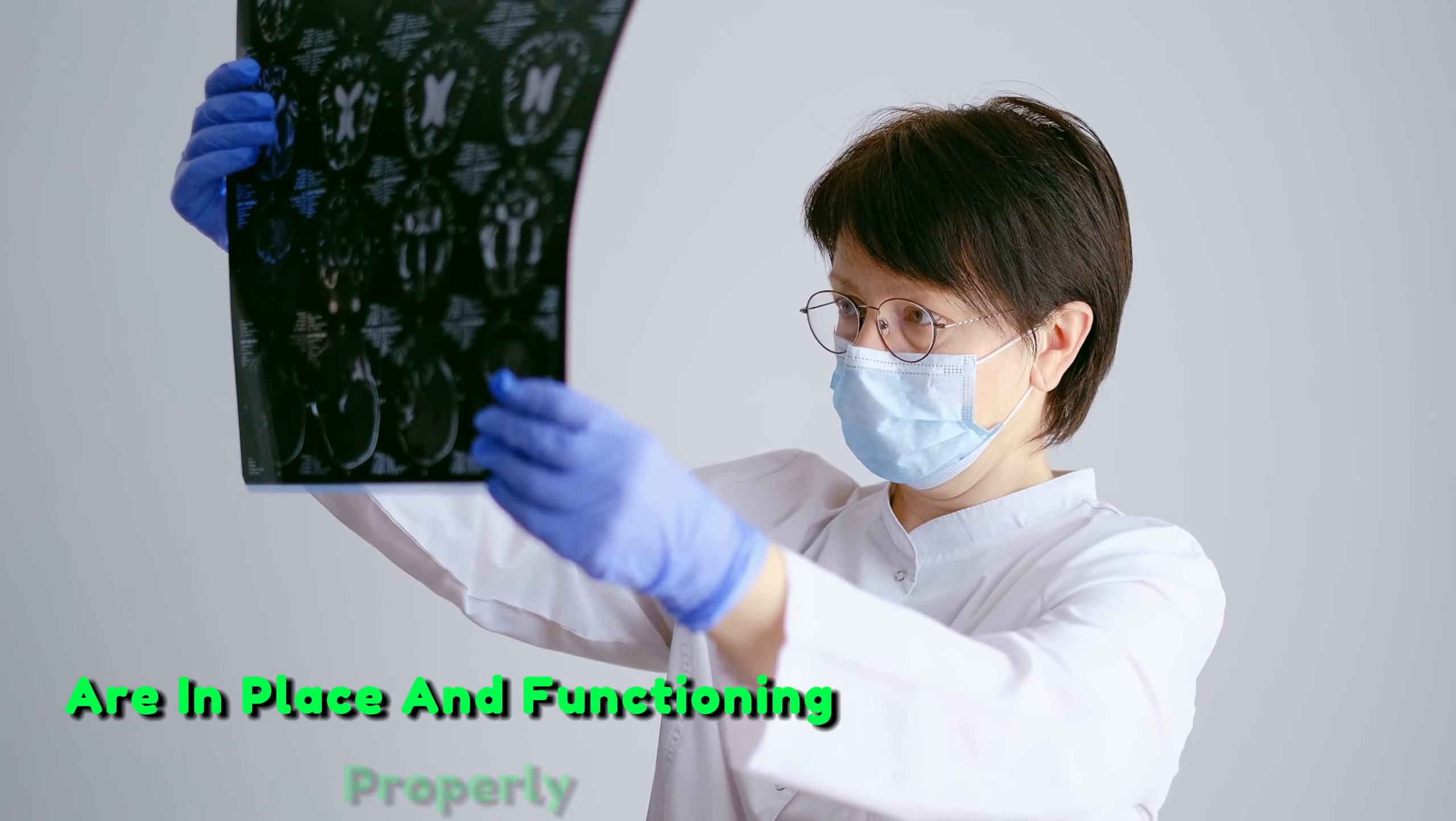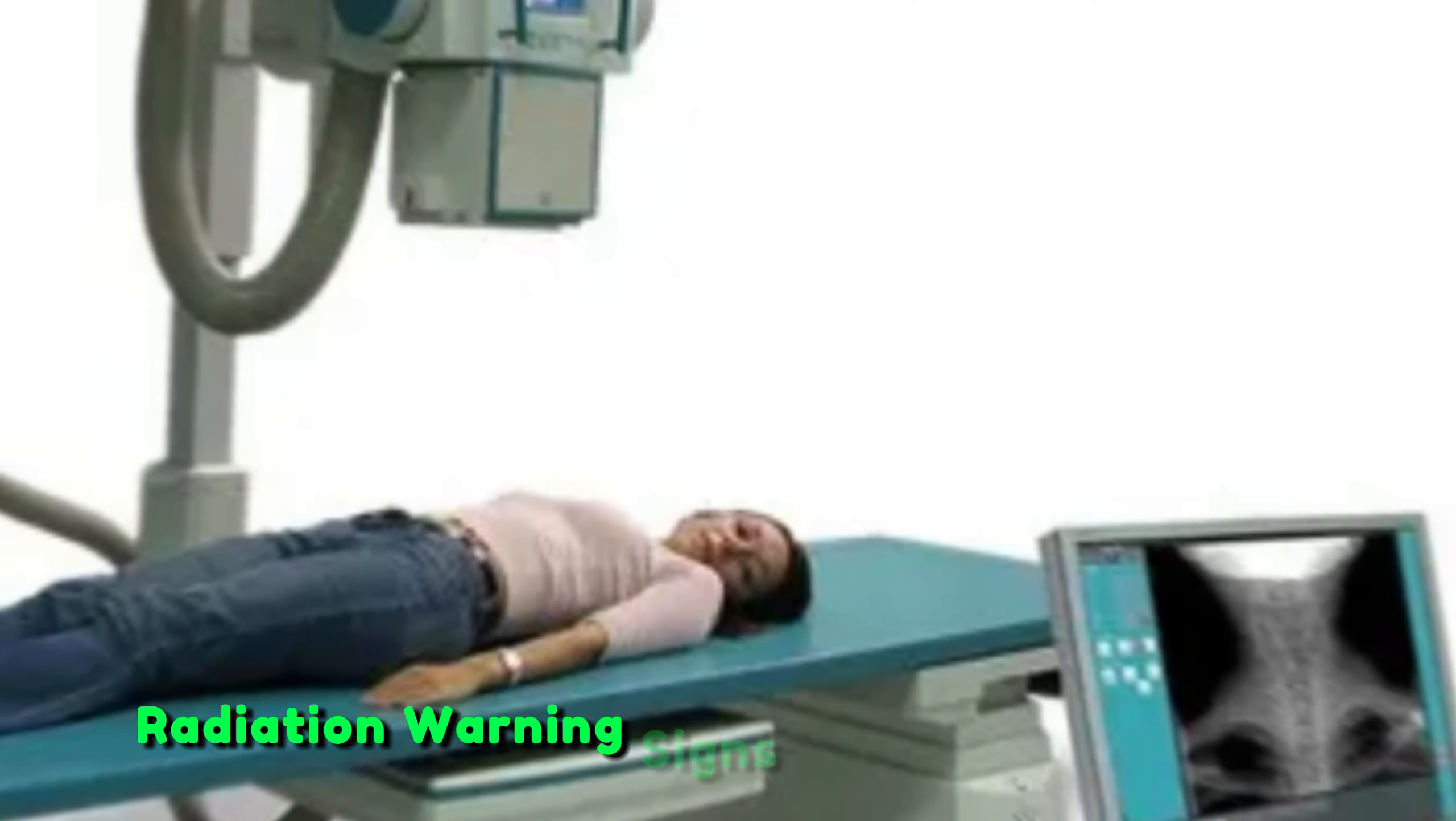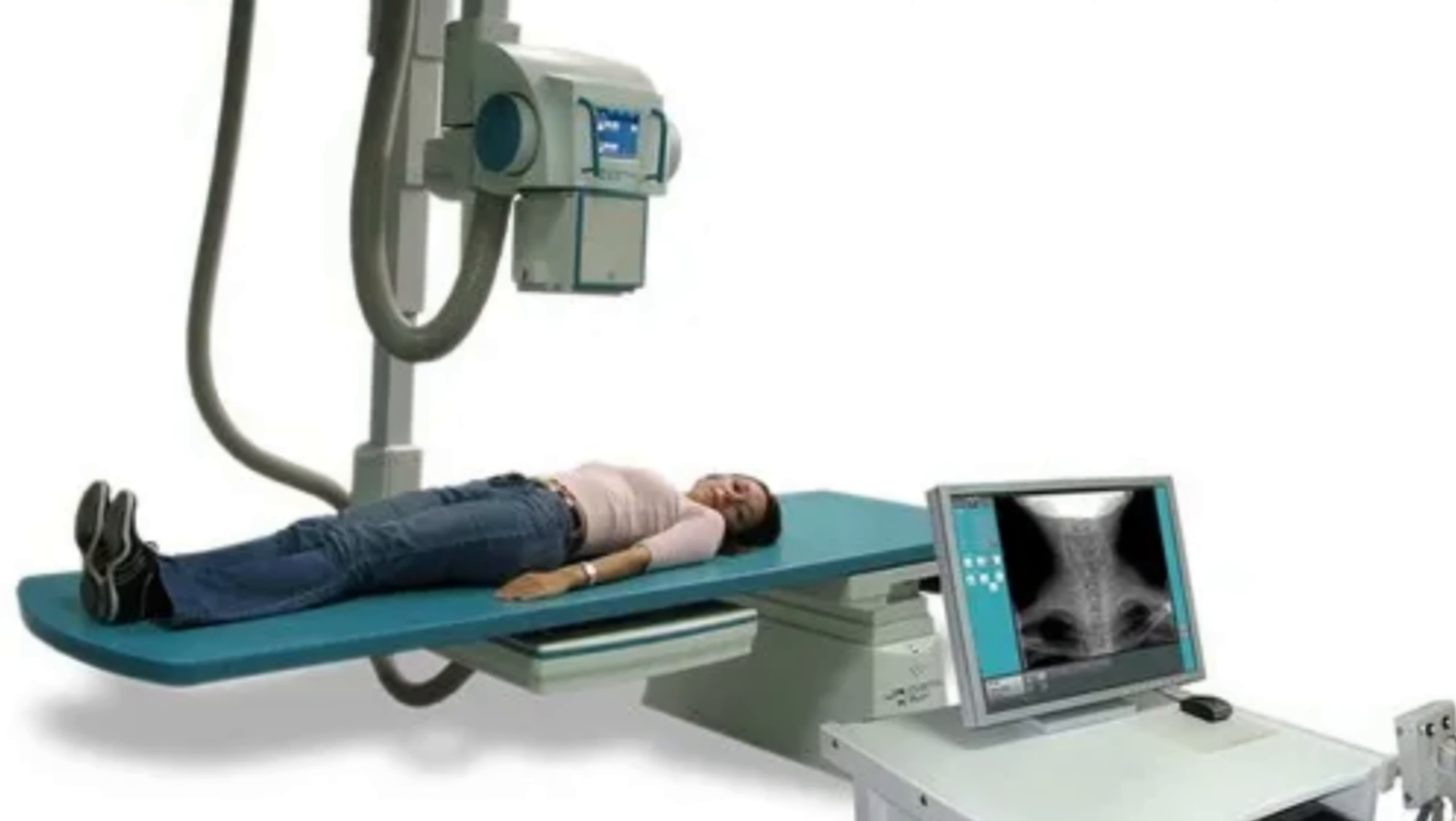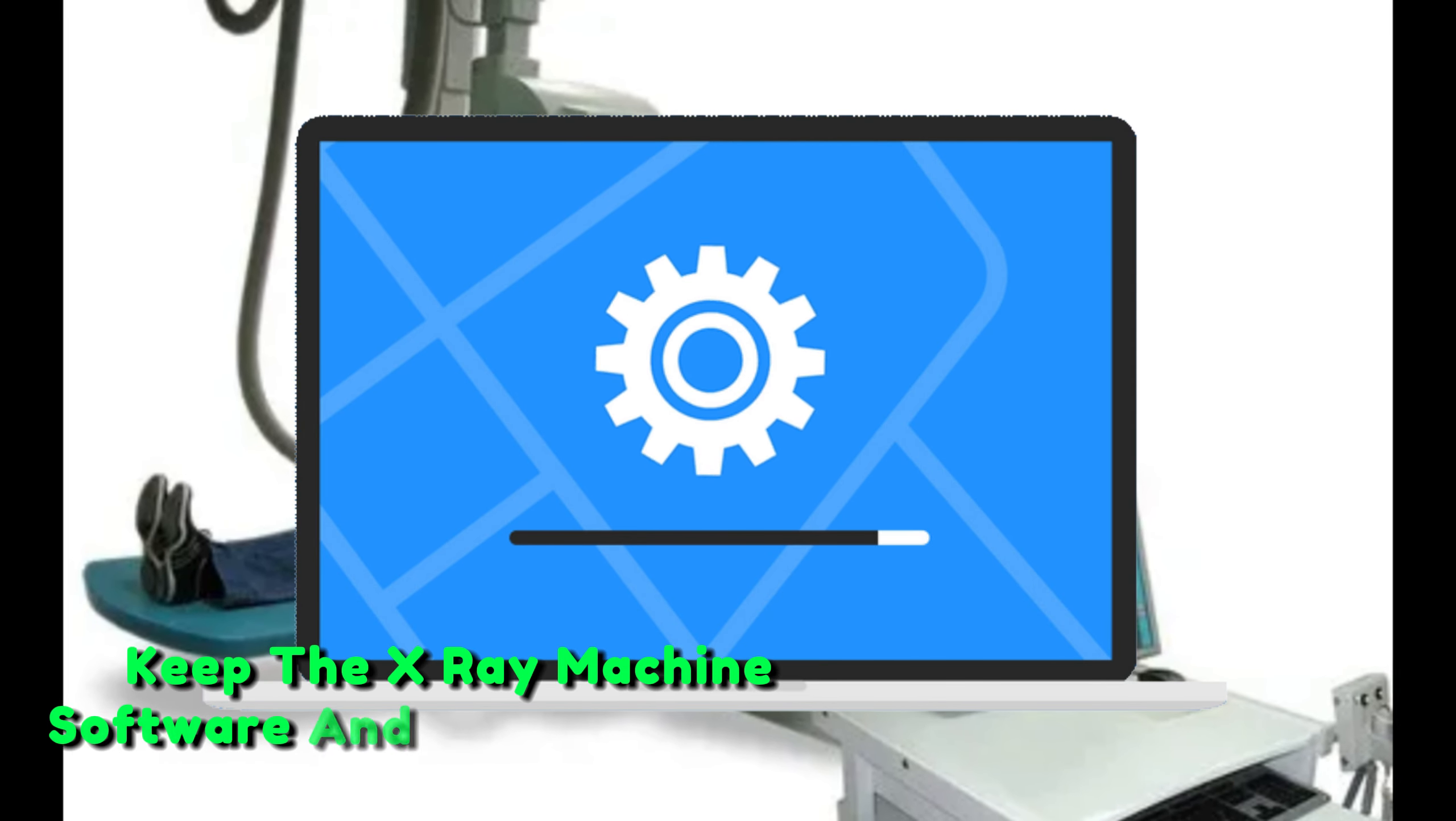Radiation safety measures. Ensure that all radiation safety measures are in place and functioning properly. This includes checking lead shielding, radiation warning signs, and emergency shut-off mechanisms.